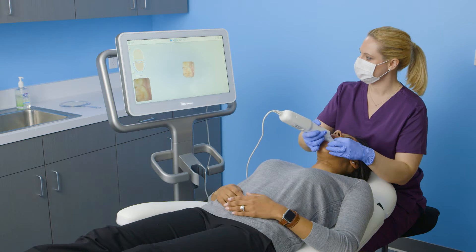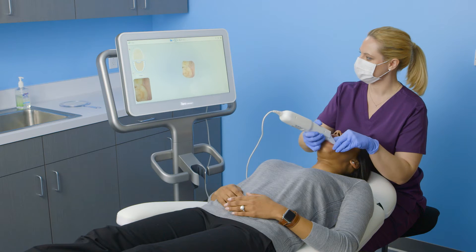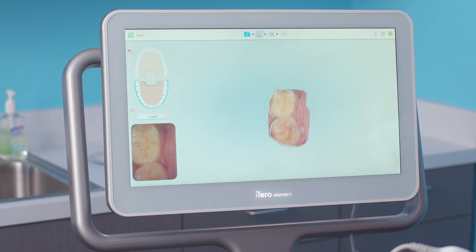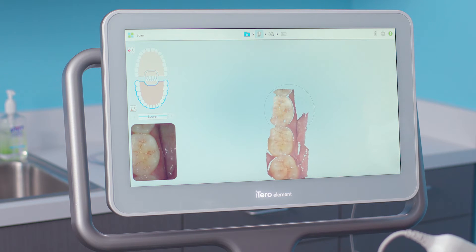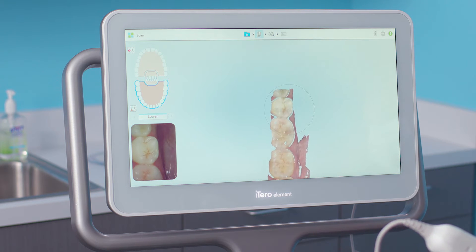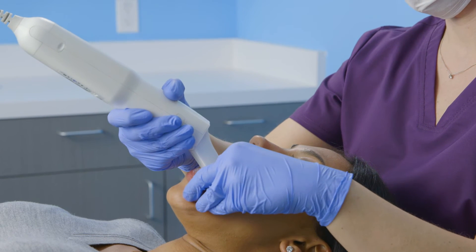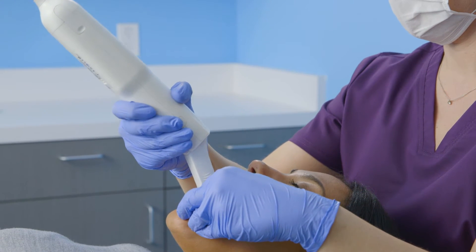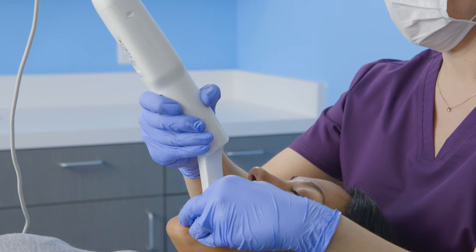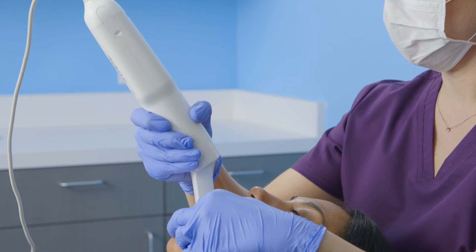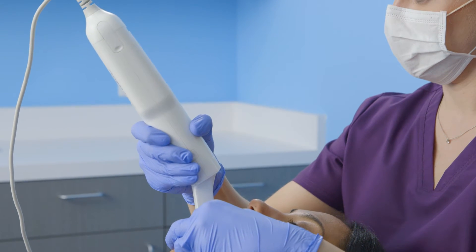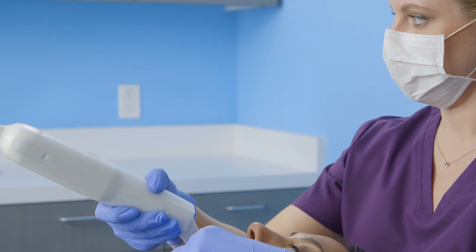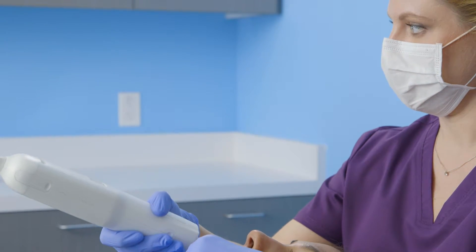I'll begin by scanning the entire occlusal of the arch. Being sure to keep the wand flat on the occlusal, I'll steadily bring the wand toward the anterior. When I reach the bicuspid, I'll continue across the anterior, tilting slightly to the lingual, and at the contralateral bicuspid, proceed by moving the tip straight back to the opposing terminal molar.